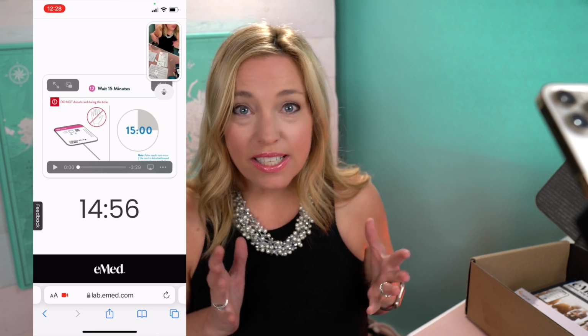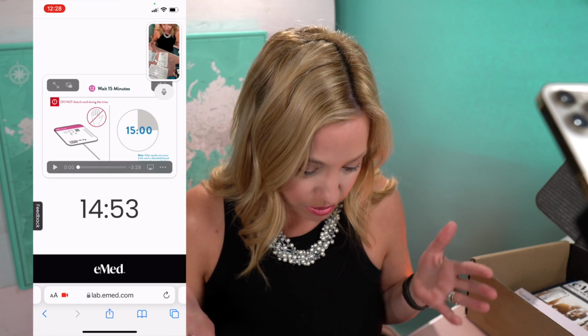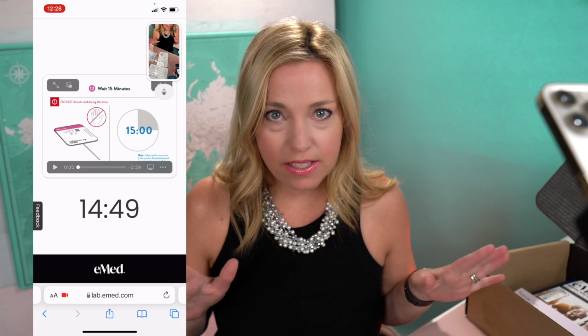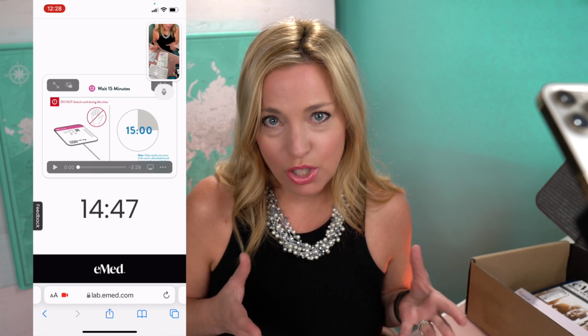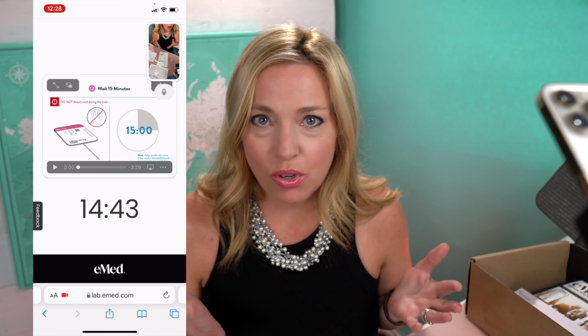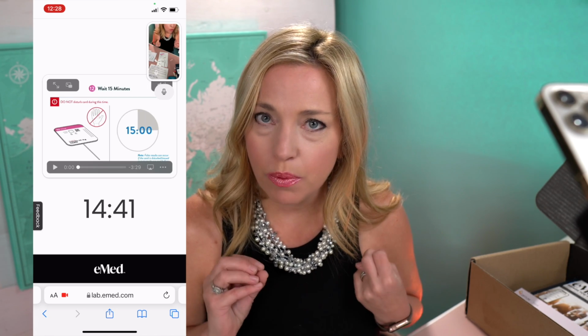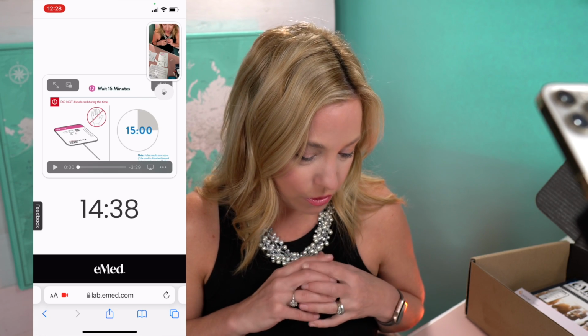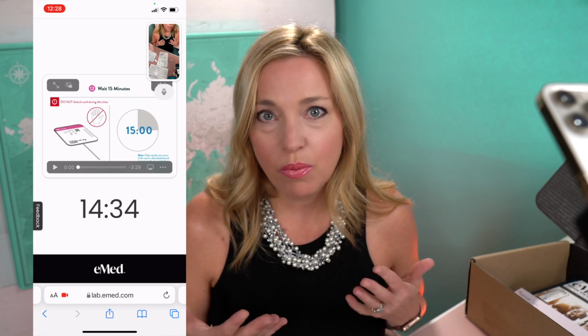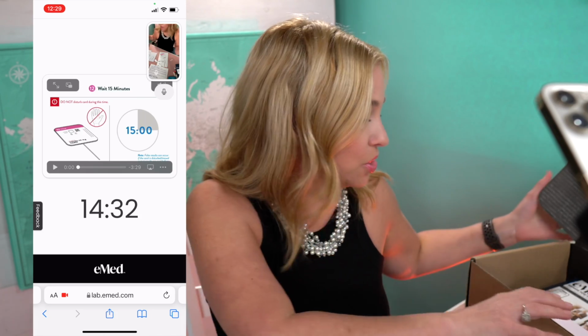Okay, that was really smooth, really easy, very fast. So now the card is sitting on the table and I can't move it. I can't pick it up and show it to you because it has to remain there for 15 minutes. But my proctor was great. I would say the audio was really low. It was a little bit difficult to hear him, but so smooth and so easy. Wow. Especially when you get right on with a proctor, that felt so good.